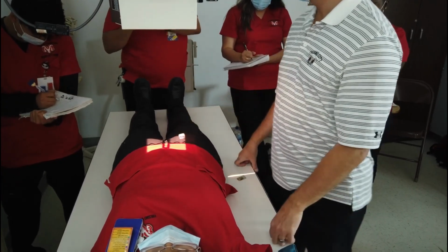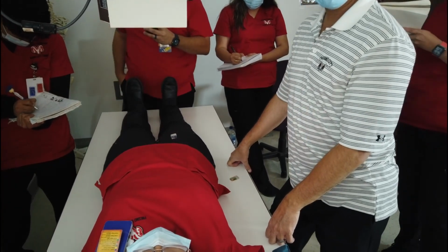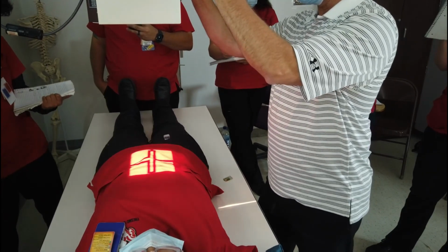Right marker. Am I midline? Yeah. Okay. Easy breezy. Take the angle off, we're going to do the obliques.